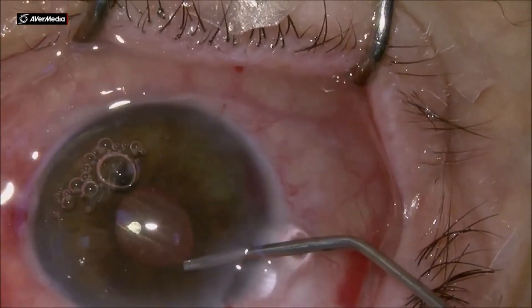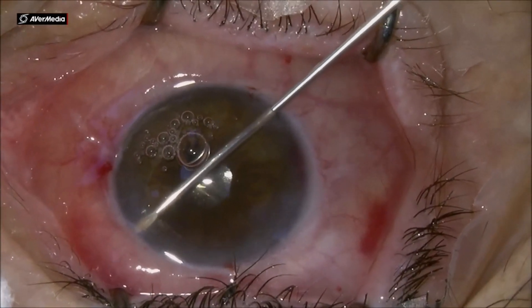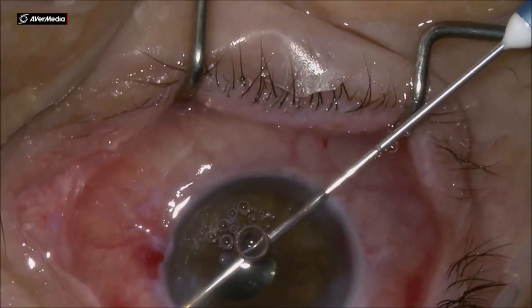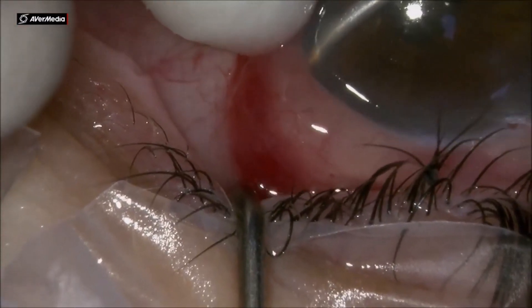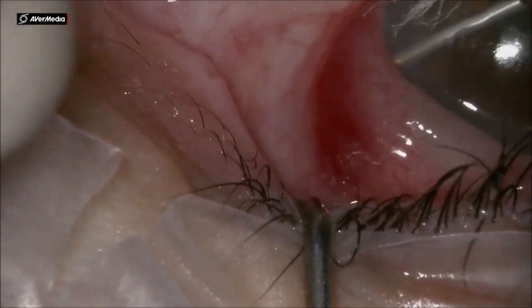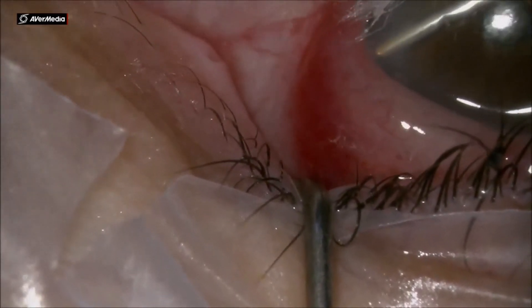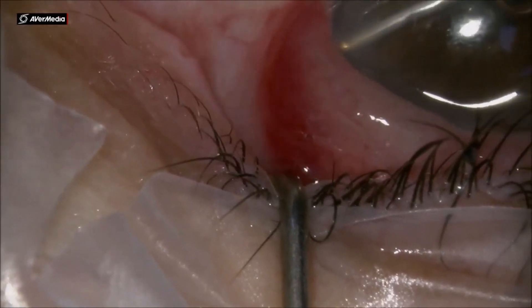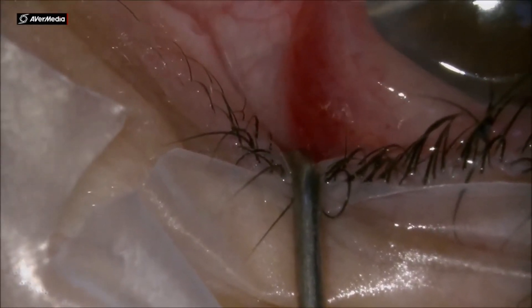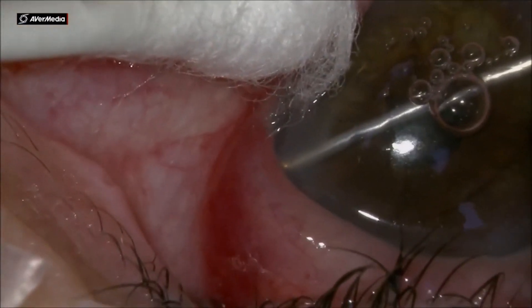This is a sclerectomy done by the needle passing through the trabecular meshwork and through the sclera. Notice that in this passage you always turn the needle so you create a tunnel — not just a cut. Creating a tunnel ensures that the aqueous humor will flow underneath the conjunctiva, forming a bleb. If you instruct the patient to do ocular massage a couple of weeks after surgery, that will ensure the patency of the sclerectomy and keep it open as long as the patient continues the massage.